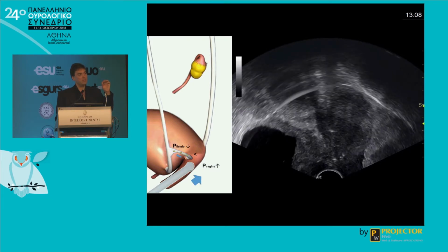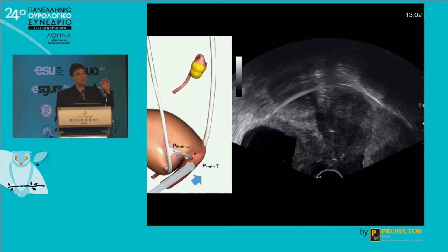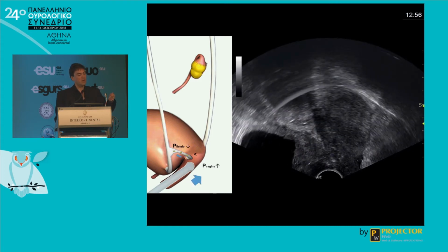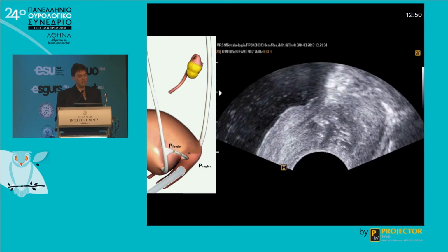You can find also a channel of 1 millimeter of a fistula. You haven't any chance to find it with X-ray really exact, because sometimes it is closed, but with pumping you can open it and you go forward and backward and you will see it.